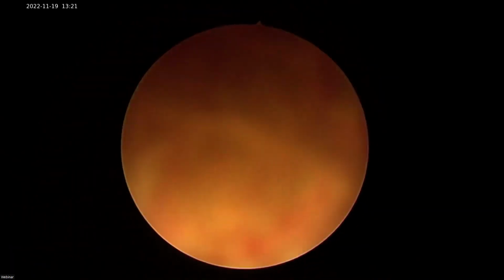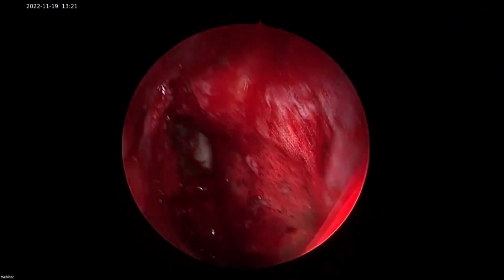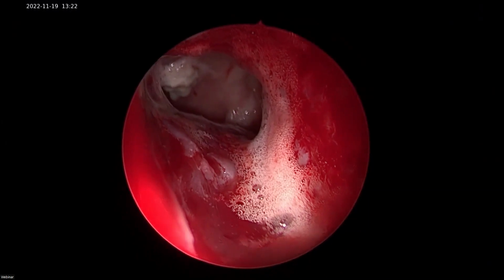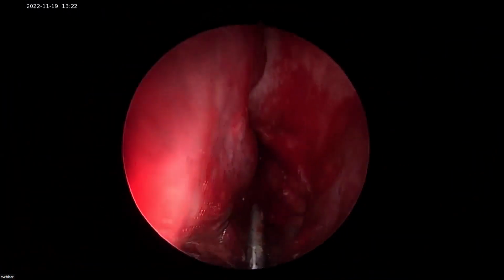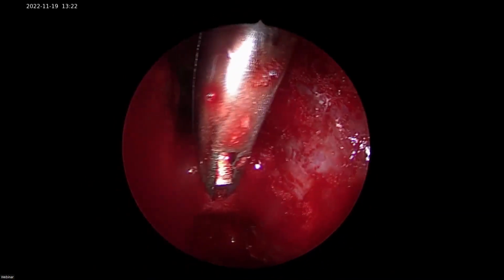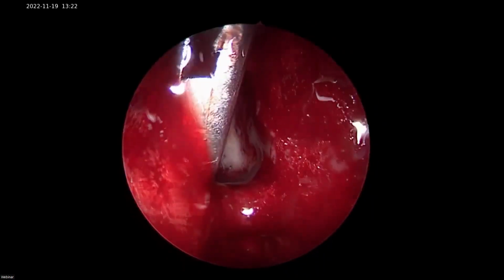Madam, I'm in the frontal. So even the frontal forceps are not reaching there because of the posterior wall. And the flush is also not working, because flush is not going in that direction. Something has to go 90 degree. Flush from behind instead of front and see. I tried even that.